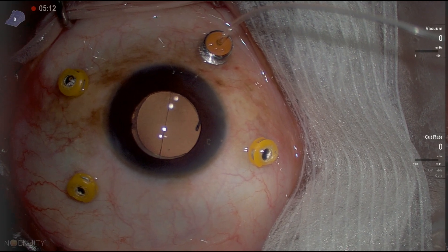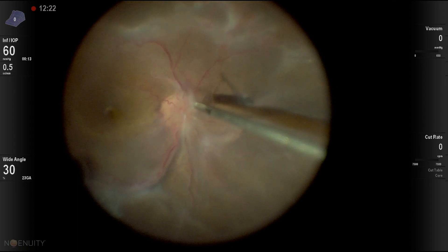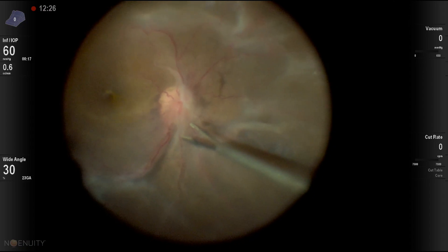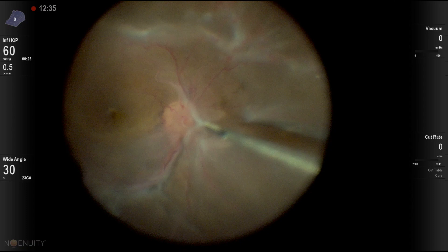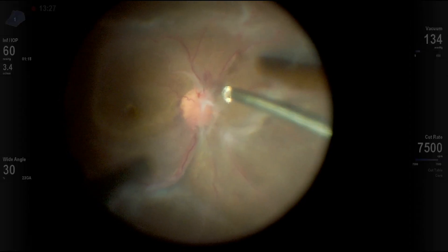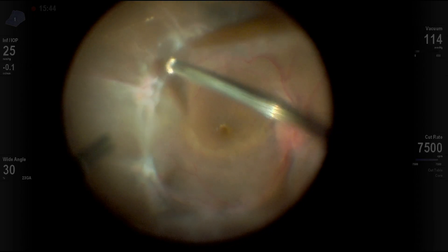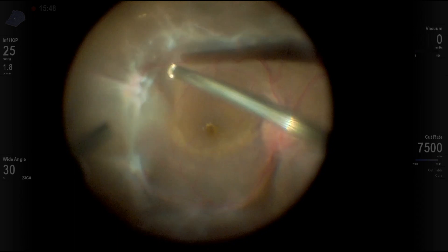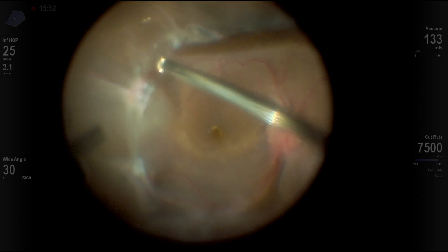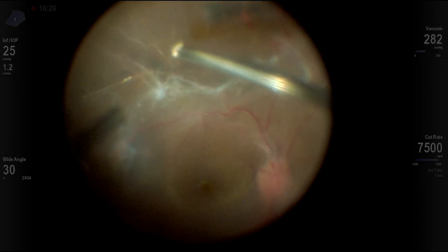Here's the start of the surgery with a chandelier in, starting with vitrectomy just to clear some vitreous. Then I go to the disc and start the dissection from in out. Using a forceps here, I'm pulling on the disc just to start the dissection plan, followed by the vitrector to clear some of the vitreous. The use of vitrectomy is very efficient, but the problem is with the vitrector and the retina detached, there's a high risk of creating retinal breaks, so one needs to be very careful.